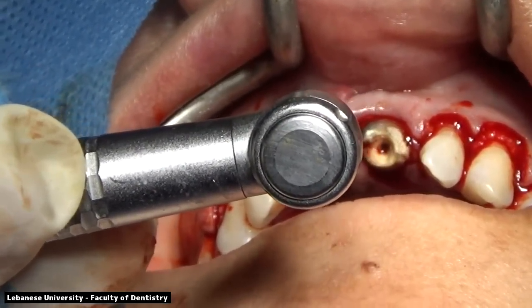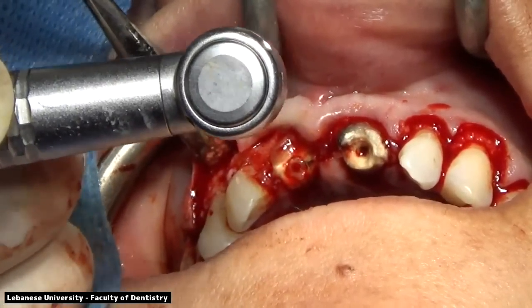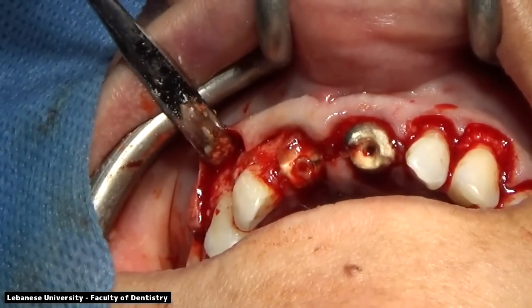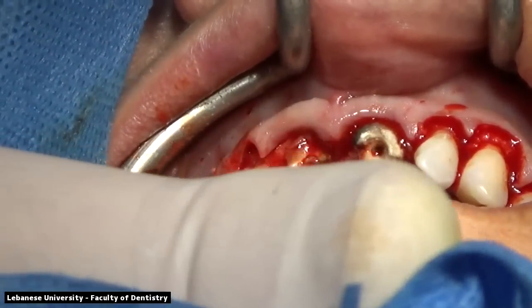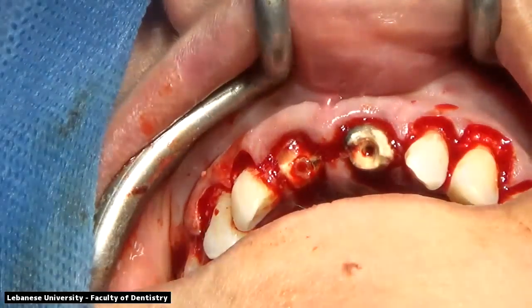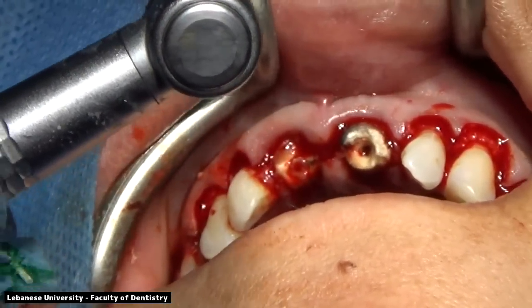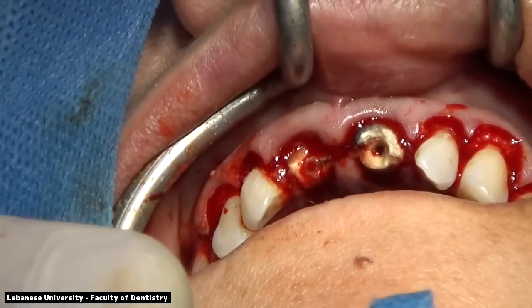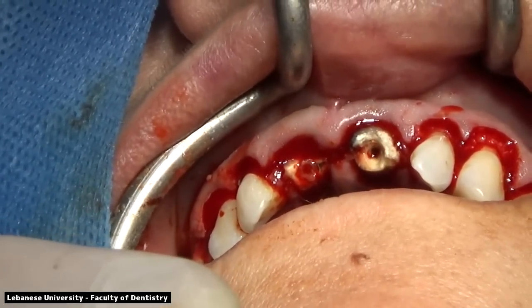If you are just joining us right now, we would like to welcome you again to the case presentation, which is a live surgical presentation from the Lebanese University, from the perio department. This patient came in with a chief complaint of a broken right central incisor that was previously root canal treated, with 2 ceramic crowns placed on the right central and the left central incisors. Both teeth were previously root canal treated, thereby becoming more fragile and more prone to fracture. The right central incisor was decided to need extraction because the fracture was below the bone level. Whereas the left central incisor, once the crown was removed, there was some decay.